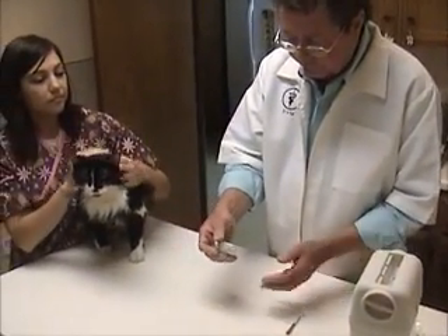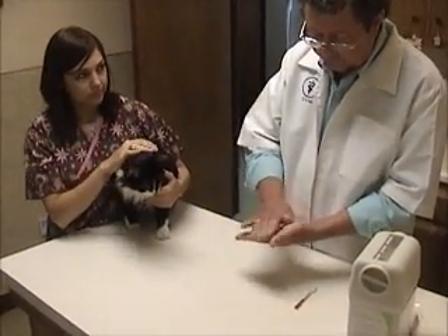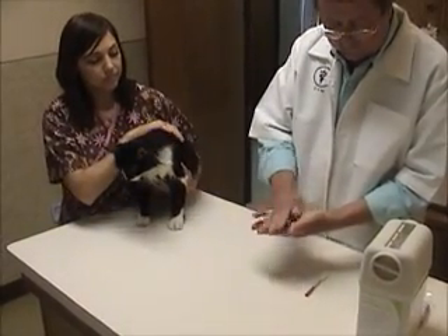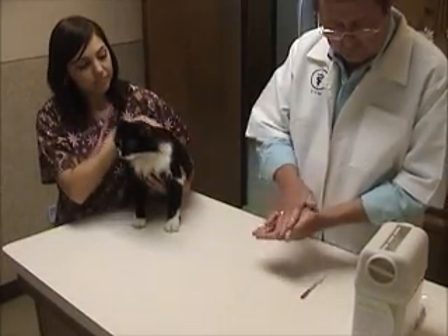With the insulin, it's come out of the refrigerator and instead of shaking it up — because it's a suspension, we want to mix it evenly — what we're going to do is just roll it in our hands for 10 or 15 seconds or so, and just kind of invert the bottle just a little bit, very, very gently.